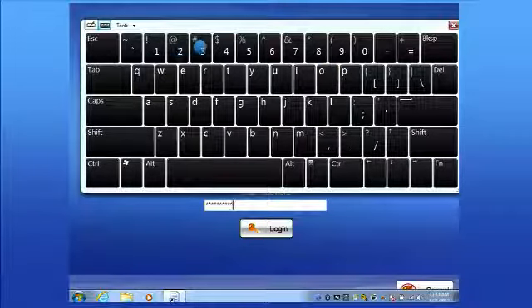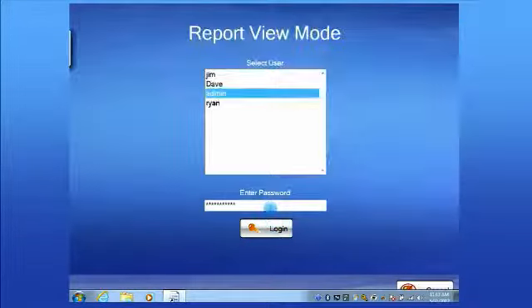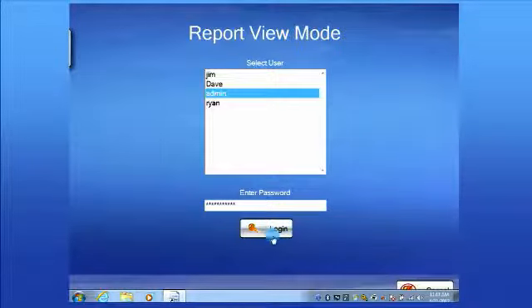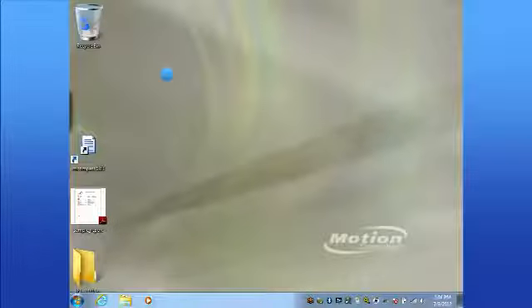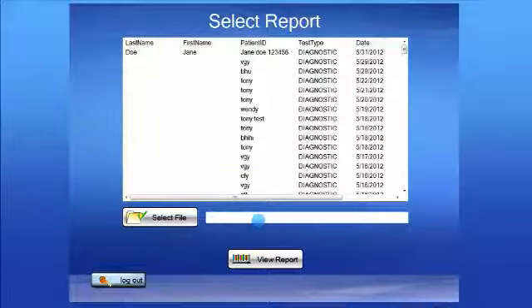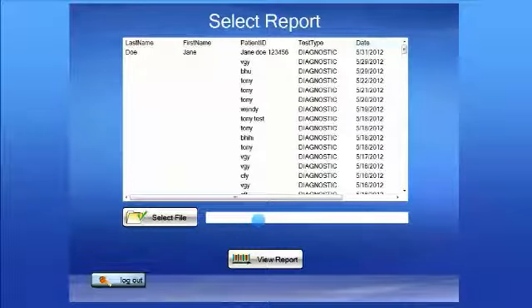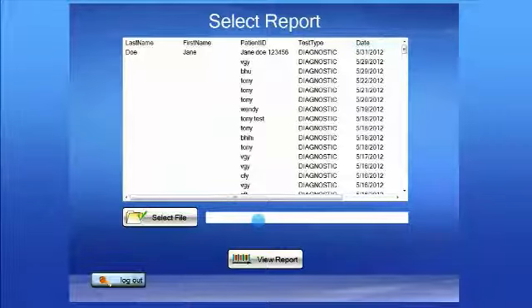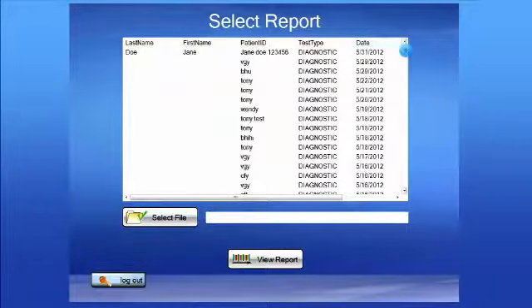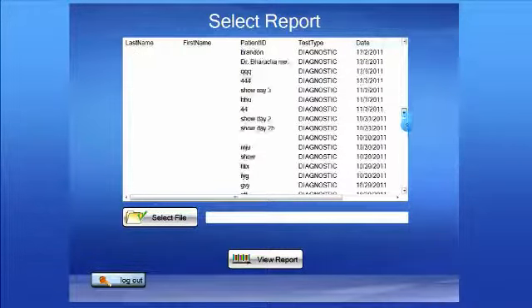Enter your password and log in. It will bring you up to the view report. The reports are put in chronological order, the most recent at the top, and older reports would be at the bottom.